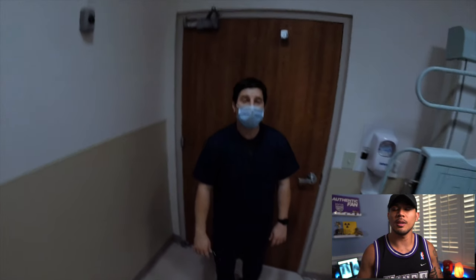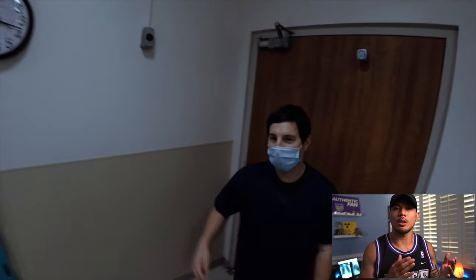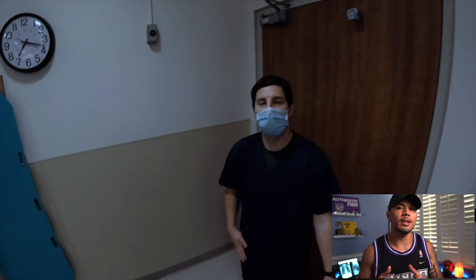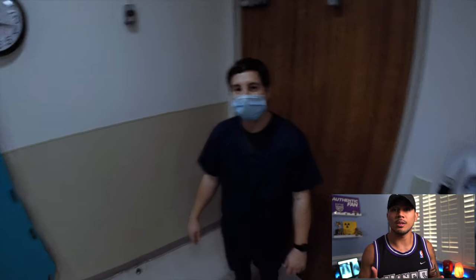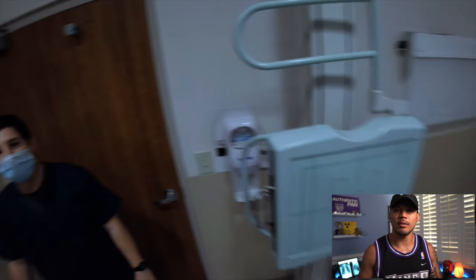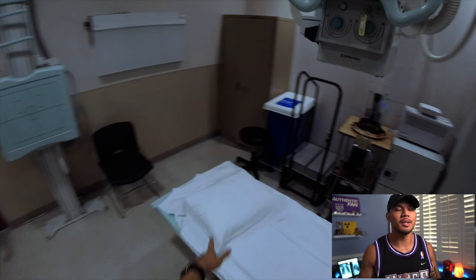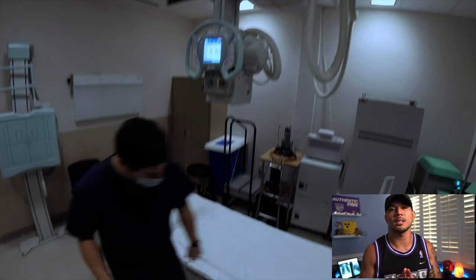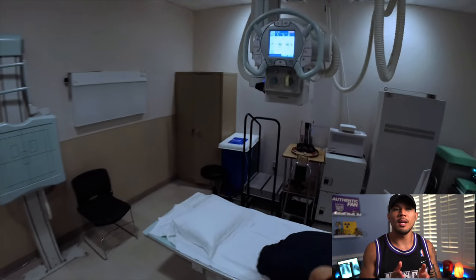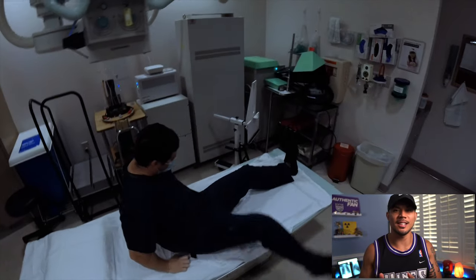So off the get-go with every patient, always get a brief history. We want to make sure we're doing the correct side, the correct area of interest, some back history, was there any injury to their knowledge, how long have they been having the pain for, if there was an injury, how long ago, is it getting worse, is it staying the same? Just ask all these questions, but at the same time when you're asking these questions, you want to own your exam and keep the exam going, keep moving, and not just stand there and sit there.